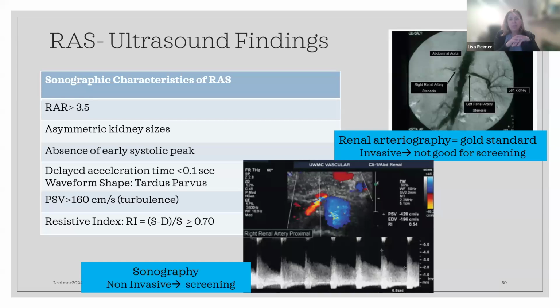While renal angiography or arteriography is the gold standard to really determine the problem, that's costly and invasive, so we are a really good tool to see if this ball is in motion. Is this starting to happen? Is a renal arteriography or angiography indicated? We're a good starting point for patients that have risk factors.